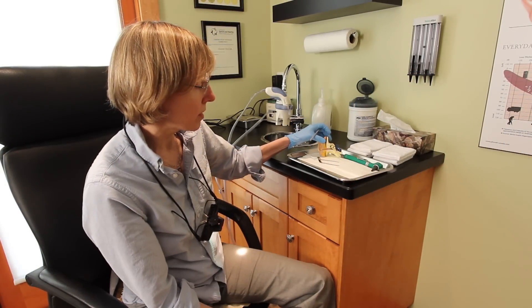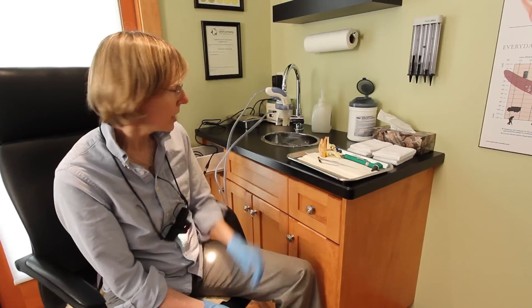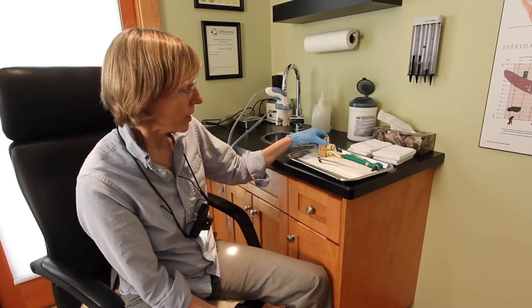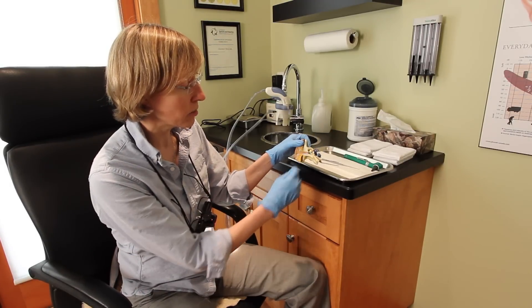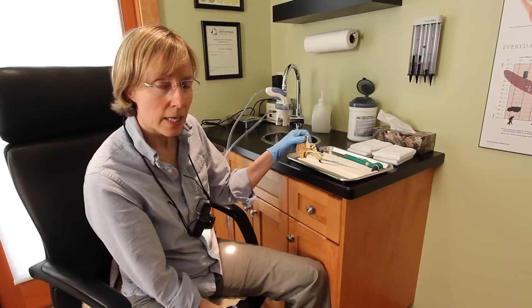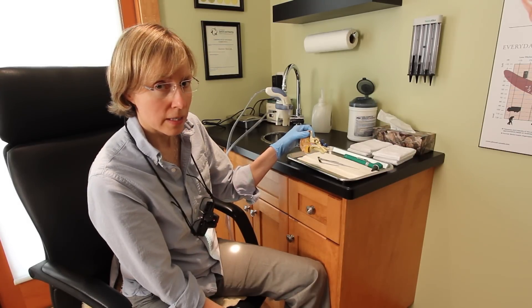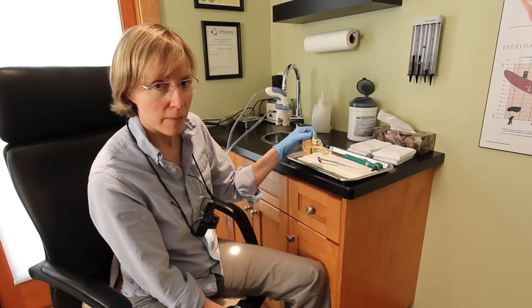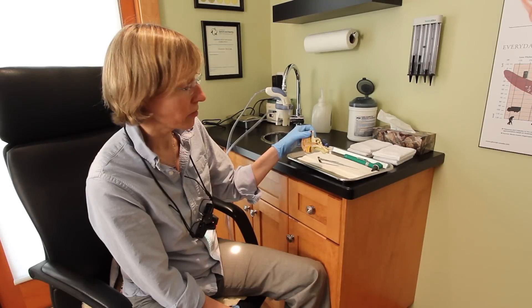Everybody's different, so depending on how much it's bothering you, we can always leave this and go and just irrigate it with a stream of water. This water system controls both the temperature and the pressure, so we don't want to heat up the ear too much or cool it down too much, because that heat transfers to the inner ear and we can cause some dizziness if that fluid starts to expand. I just warn the patient ahead of time — if they feel dizzy at all, just to let me know, and then we can stop the procedure and let their ear heat up or cool down accordingly.